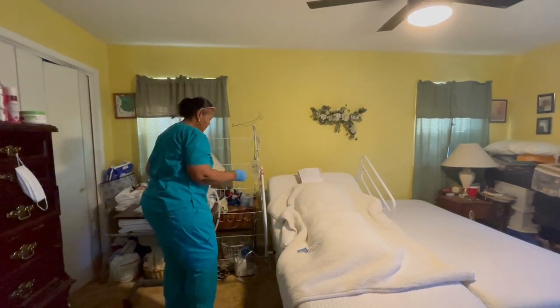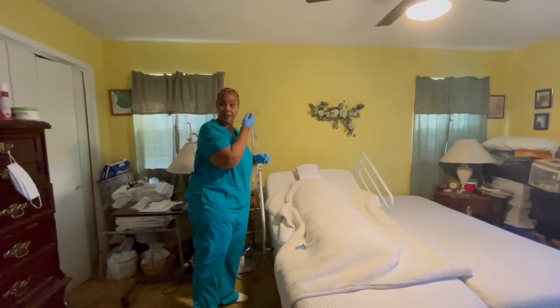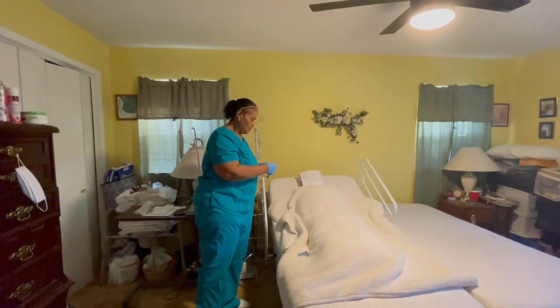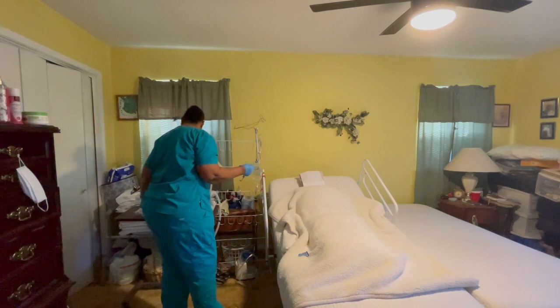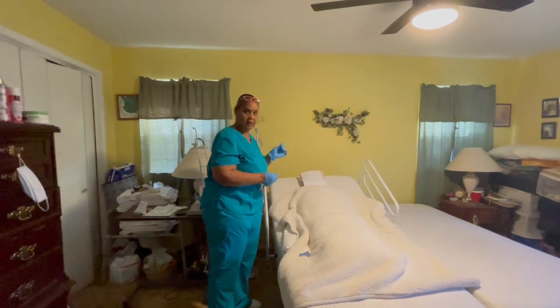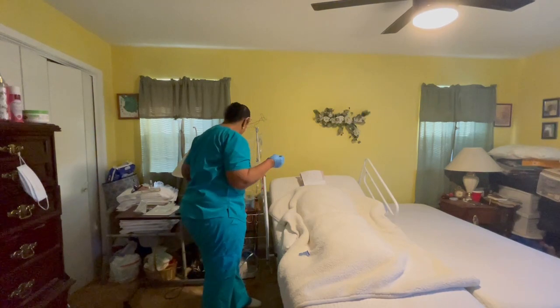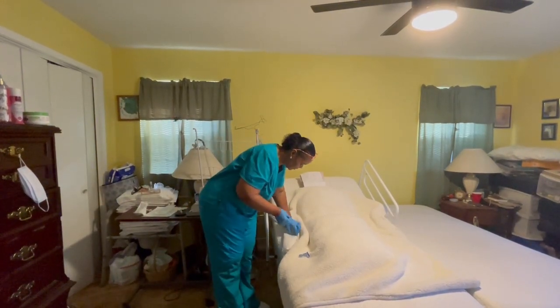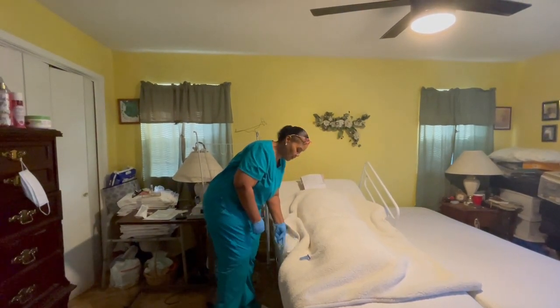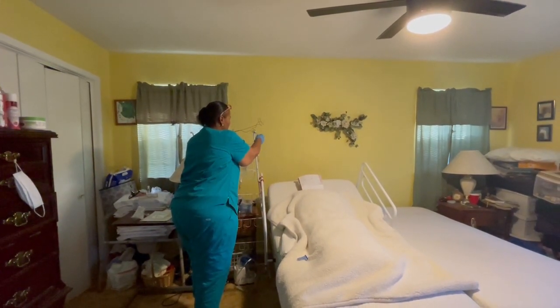And there's usually some alcohol prep things that you can put on the end of the patient's IV, okay? There is a thing for this too, as well, okay? Then you can take your alcohol prepped cap and you can place it on the hub that you just took that off, okay? Then you can go ahead and you can bring your IV back up.